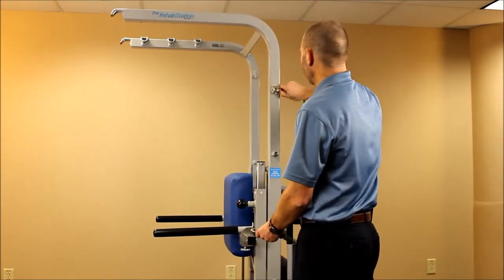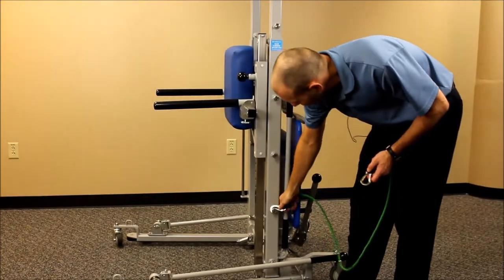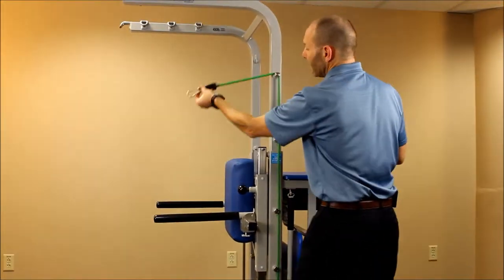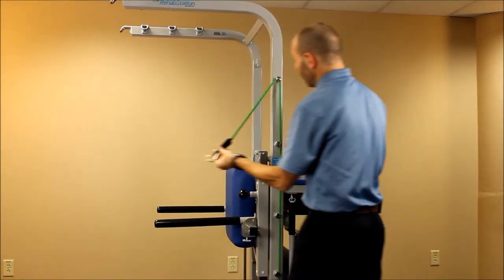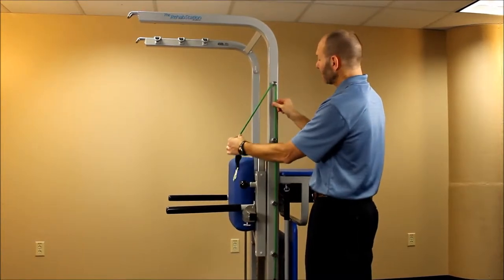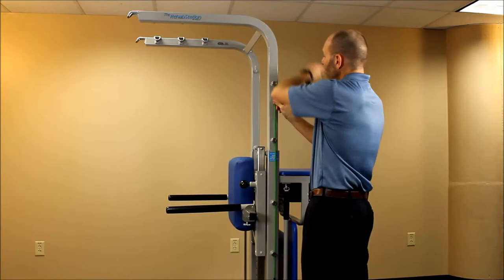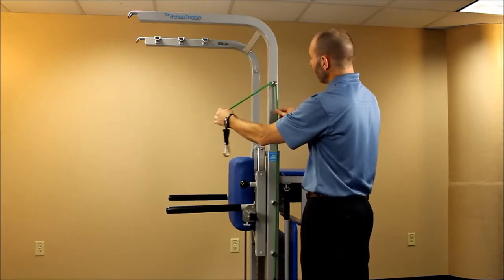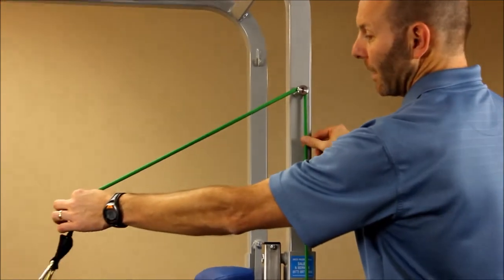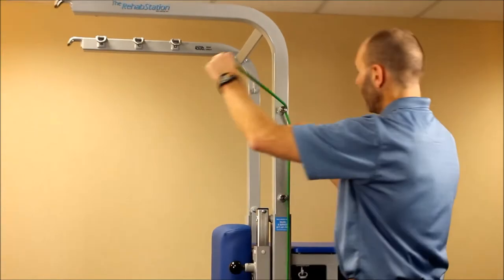If you want the resistance coming from a downward position, you would go down to maybe peg five or peg four and then come back over the top of peg one to get that particular angle. Another way to fine-tune the amount of resistance is by pulling on the tubing and looping it around the peg one time. If you want to add a little extra, feed a little extra length in, and you can fine-tune the distance and length in that way.